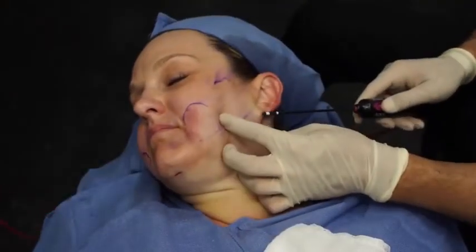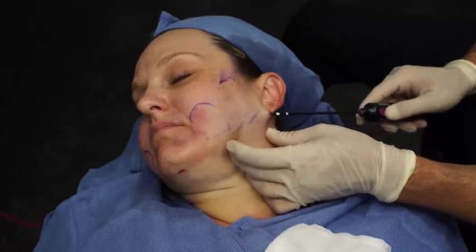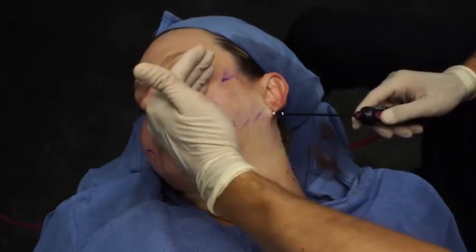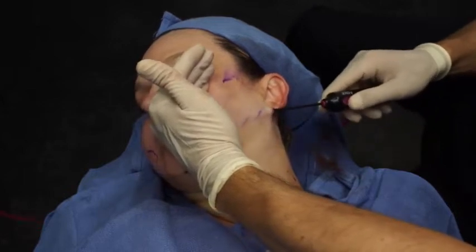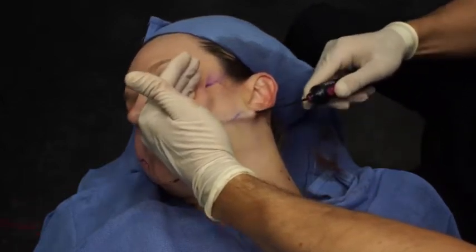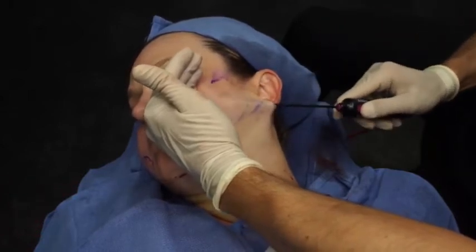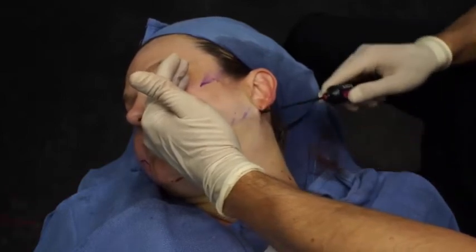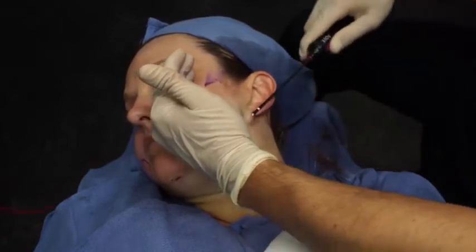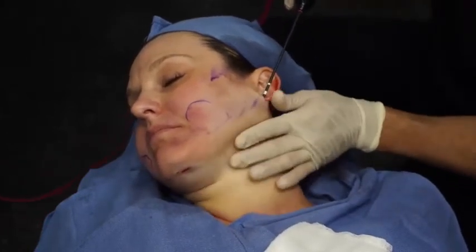Again, we're going to check to make sure that we have appropriate egress. There, we've activated in the most proximal part of the incision. You can use a second hand to prevent the egress or the movement of the gas towards the area of the face. And remember, we're doing these strokes in a retrograde fashion to prevent inadvertent gas collections where you don't want them. Here we go. And any excess gas we can go ahead and remove.